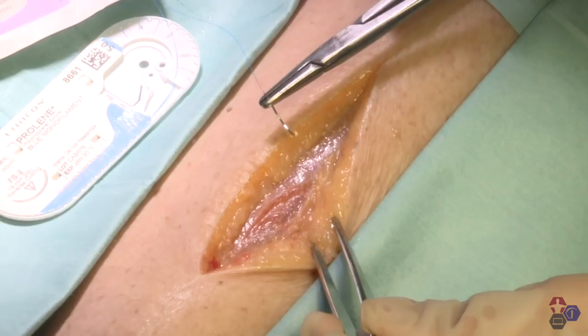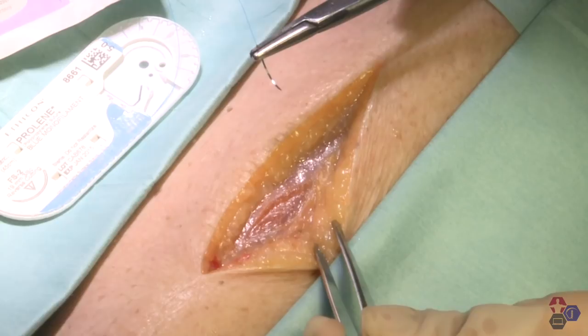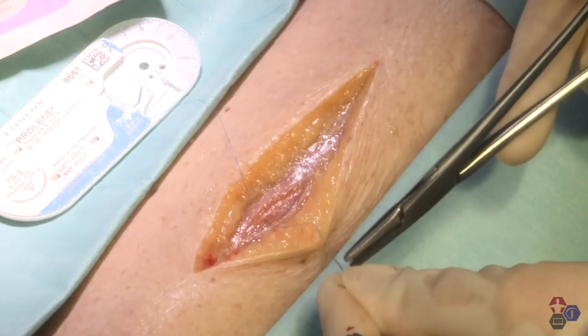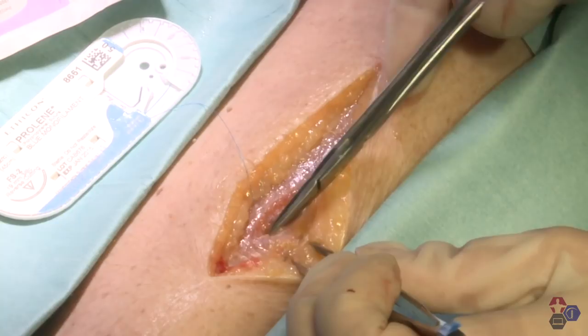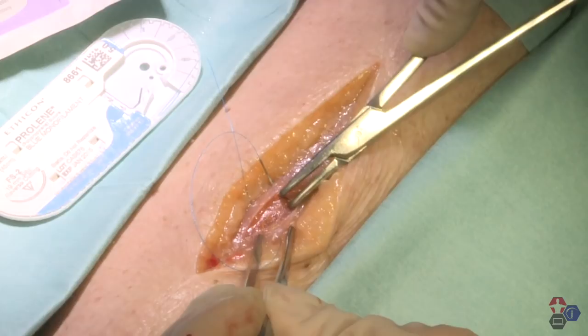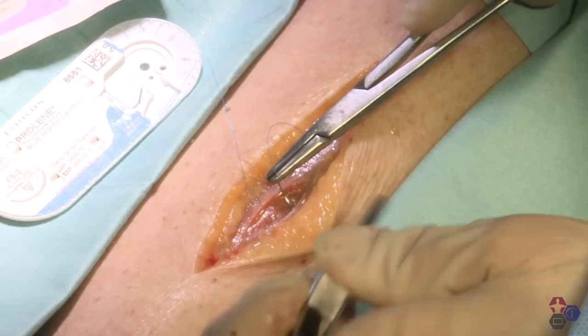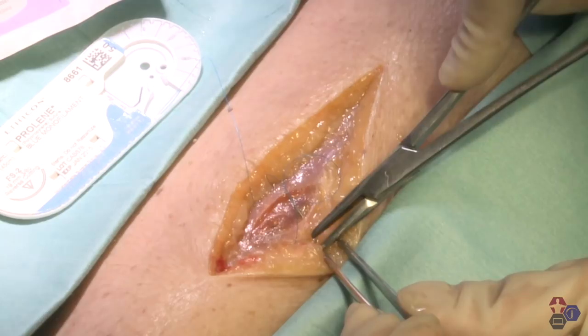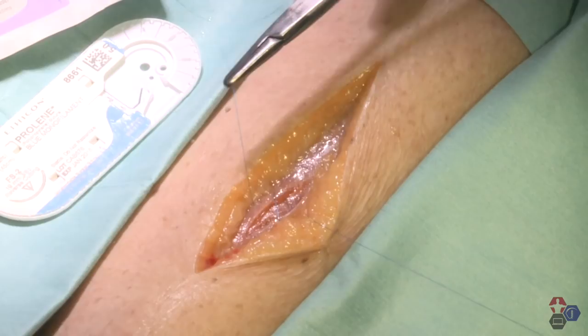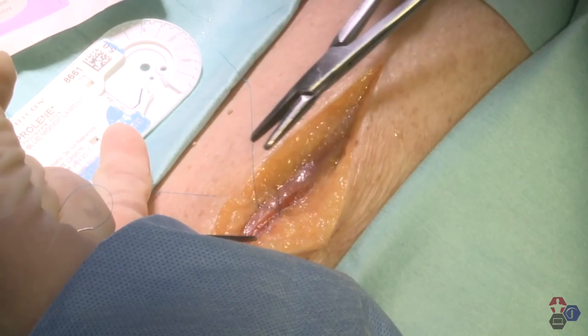You can see that there's a laceration in the fascia here, and I'm going to use a modified horizontal mattress technique called a figure-of-eight stitch to close that fascial plane. We begin by putting a large bite in the fascia on one side of the wound, finishing that off, come out on the other side of the wound, generous bites in that fascia, then cross the wound and do the same thing without cutting the suture, avoiding that loop, coming out on the other side at about the same location. As we pull our suture through, we have one part of the X, and if we approximate our suture, we've completed that X and made a figure of eight.